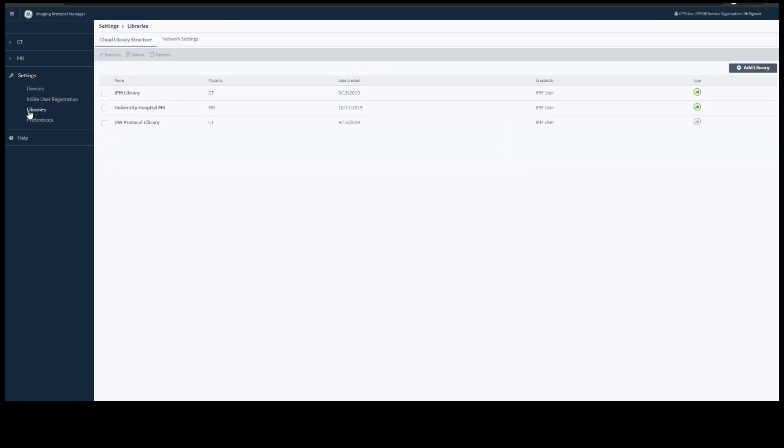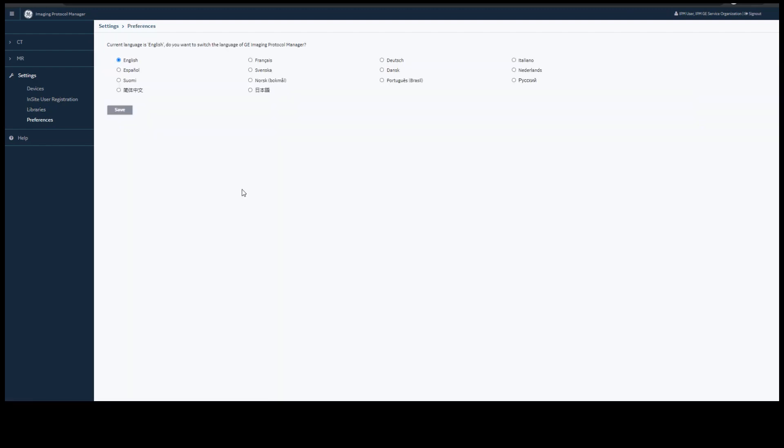In settings, you have libraries where you will set up a standard library which is denoted by the green thumb. In this example, there is one standard library for CT and one for MR, and preferences where you can change the language of the user interface.